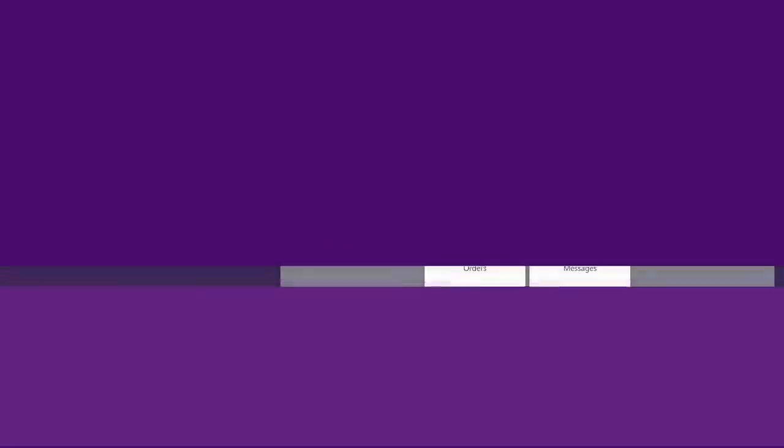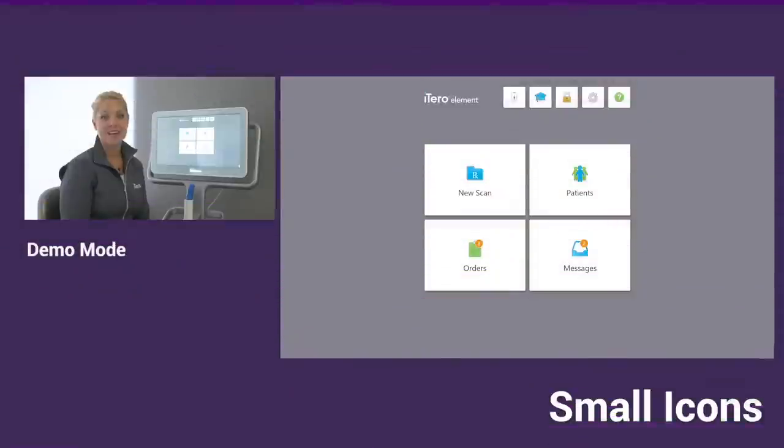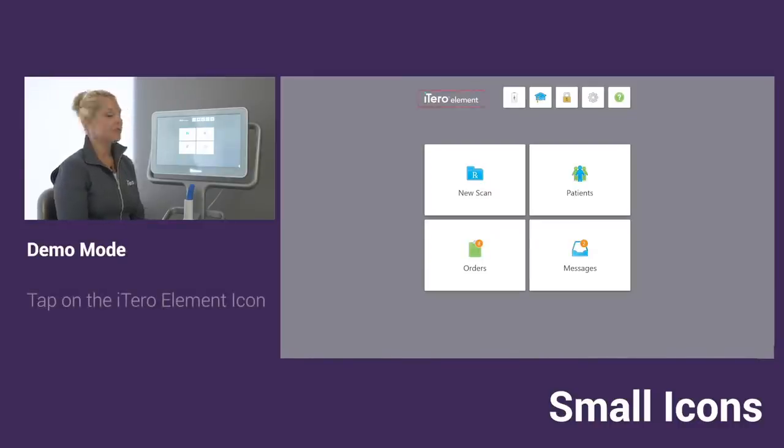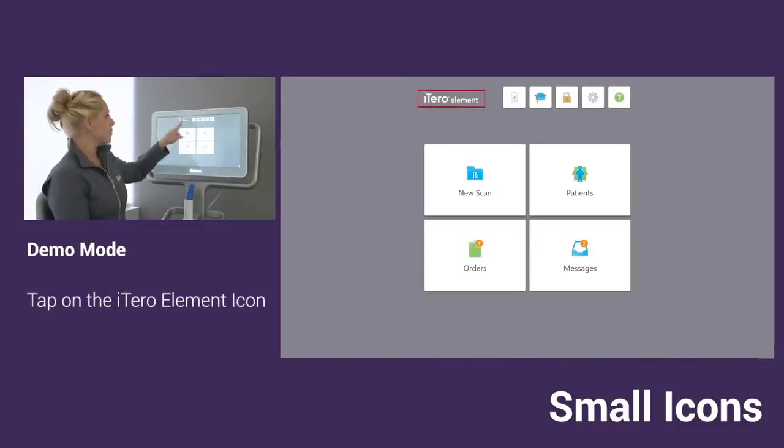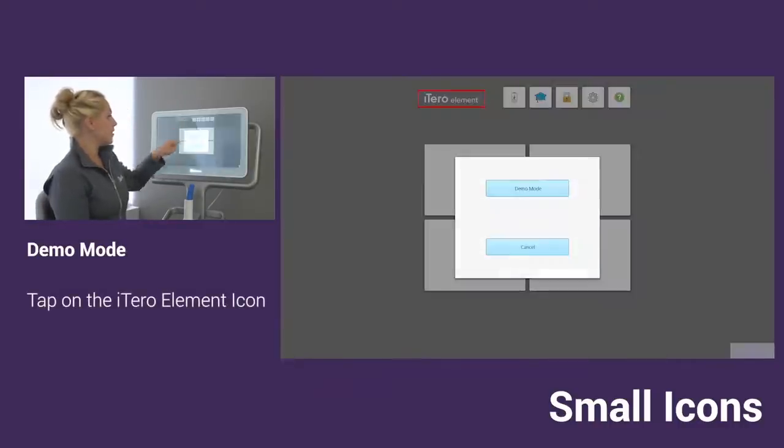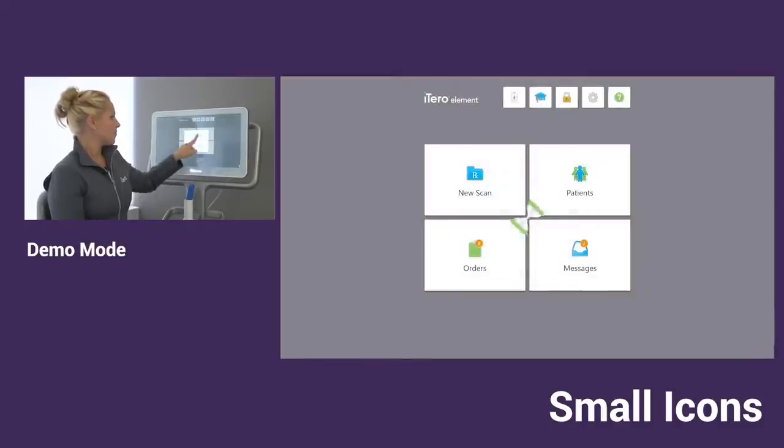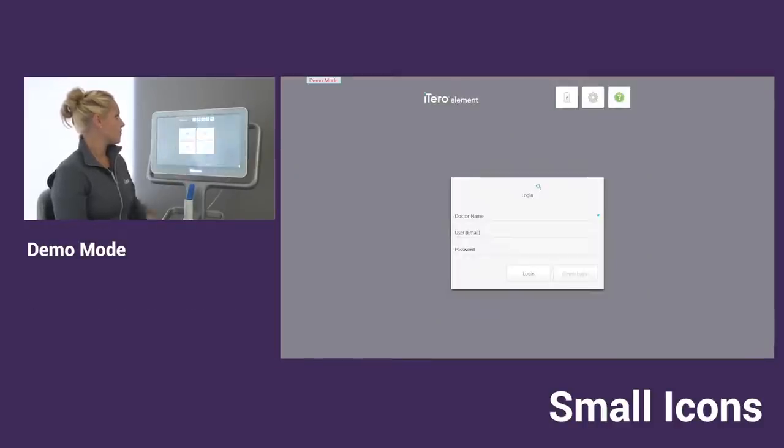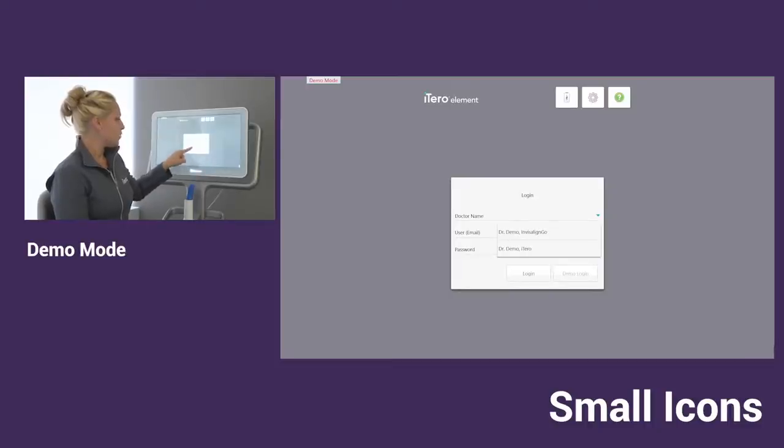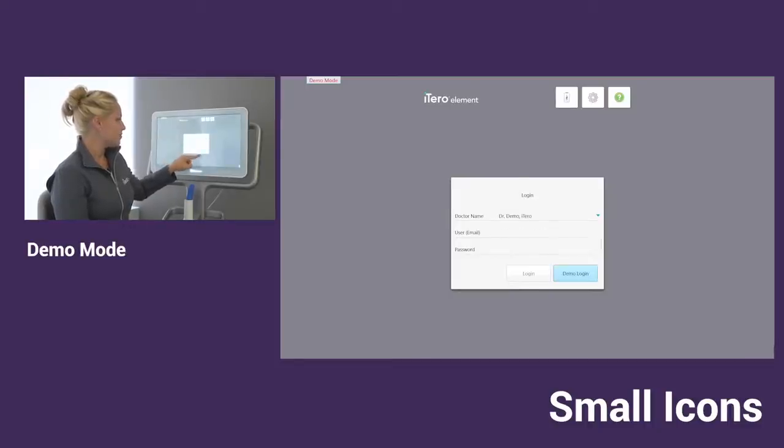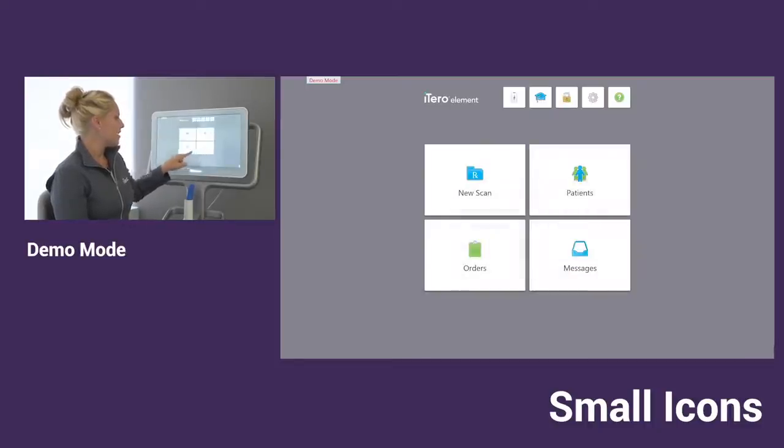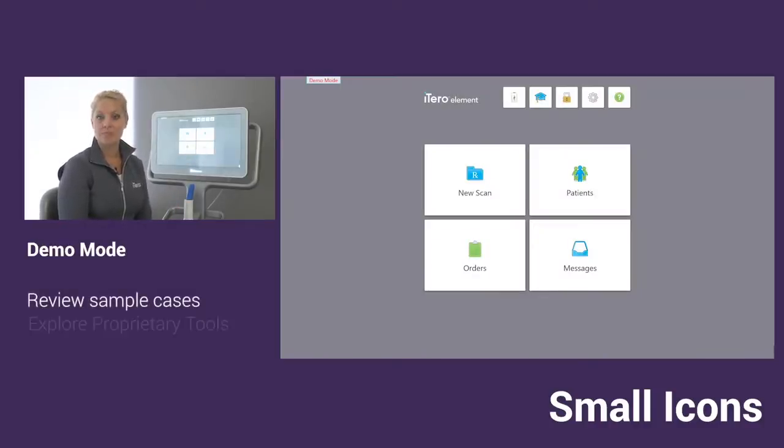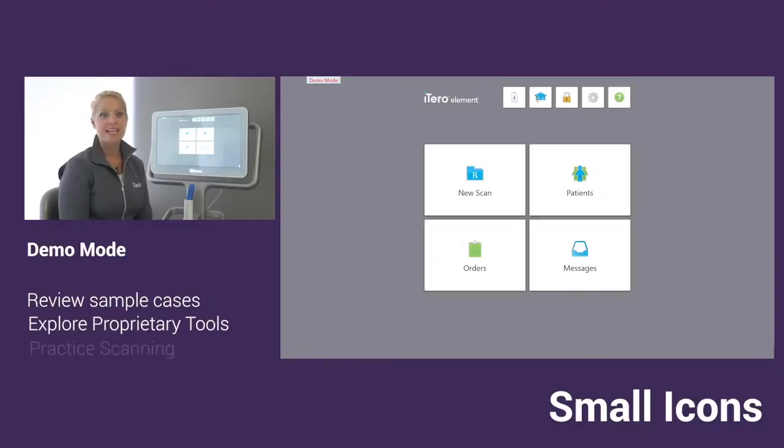Your iTero element scanner has a demo mode. To access the demo mode, we can tap right on the iTero element logo. With the demo mode, we will have the login. You can drop down and choose one of our defaulted doctor names. What's nice about demo is that it allows you to look into some practice cases and run some of the tools and features as well as do any scanning that you don't intend on sending.